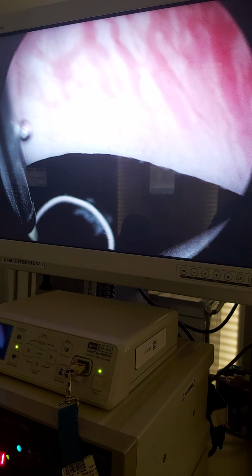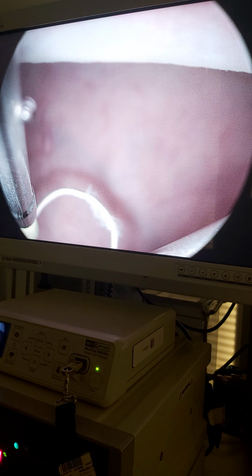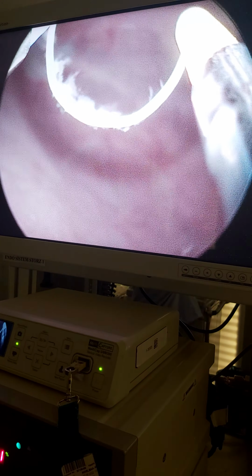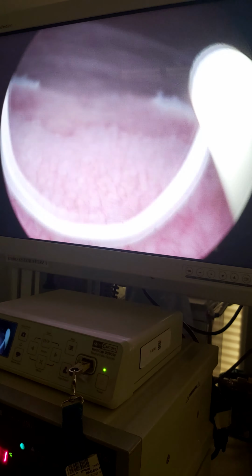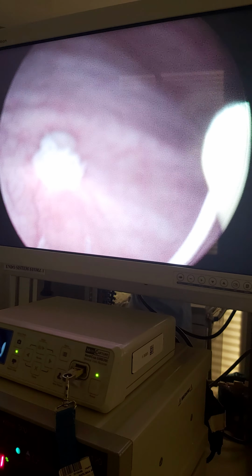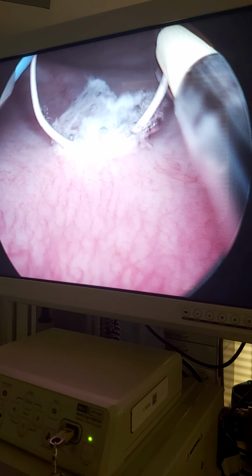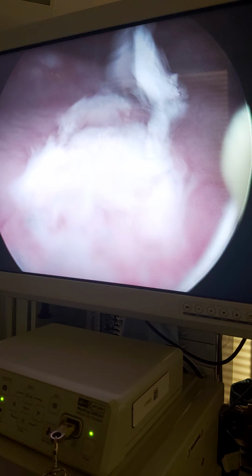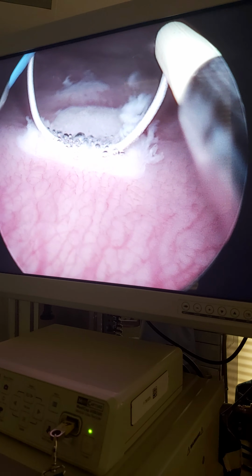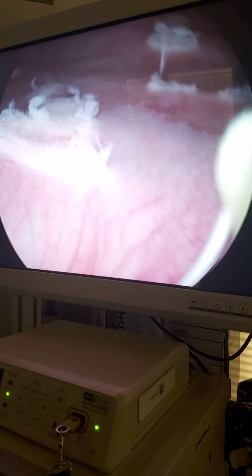Okay, difficult decision. Is it inflamed or not? We make a comment it's healthy. Okay, so I will mark the border sample right now. Okay, look at this different tissue. I'm making a superficial fulguration and control the base if it is normal. It's not easy to make a decision about the thickness.